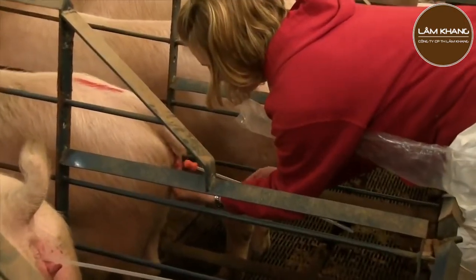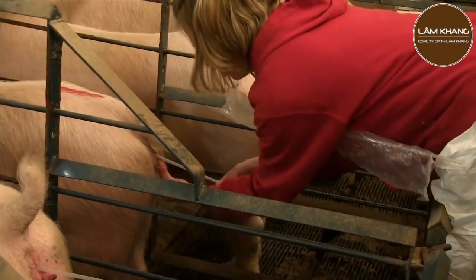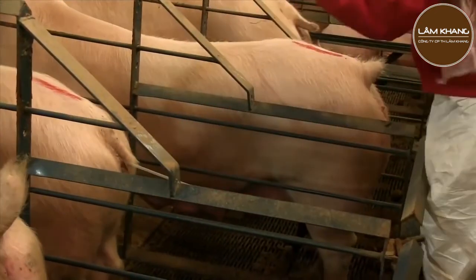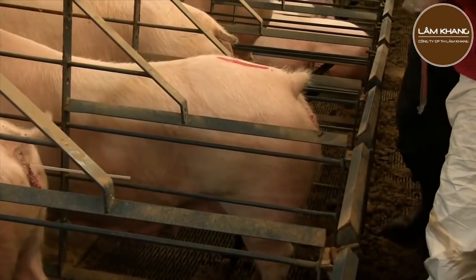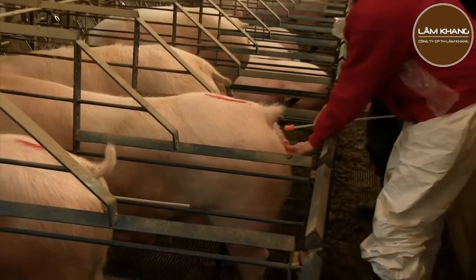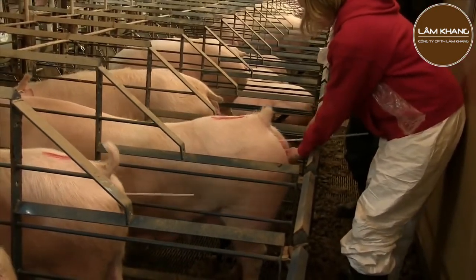If needed, a non-spermicidal lubricant can be used on the outer catheter. Take caution to not get the lube on the tip of the catheter where the inner catheter will advance through. I'm confirming that the rod is in the cervix by turning the rod counterclockwise and gently pulling back on the rod until I feel a slight resistance.